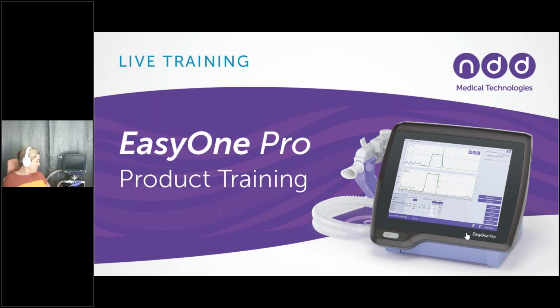I was trying to think of anything else with the Pro Lab or Pro and Pro Lab. With the purchase of this device, you do get an in-person training session from our team, whether that has to be virtual or preferably on site. You do get that training included. So we get to get hands-on with this device. Again, it does have a lot more functions than a basic spirometer.